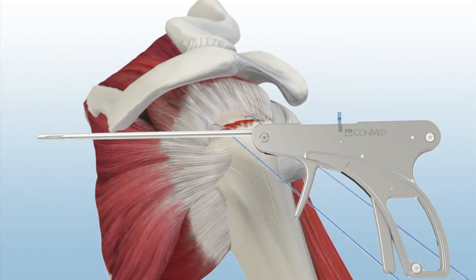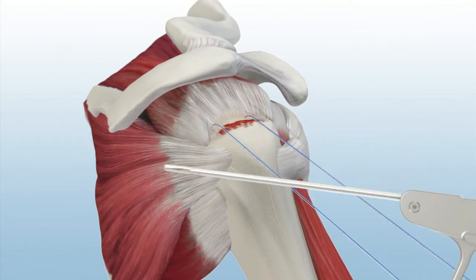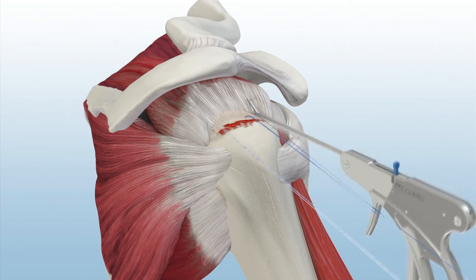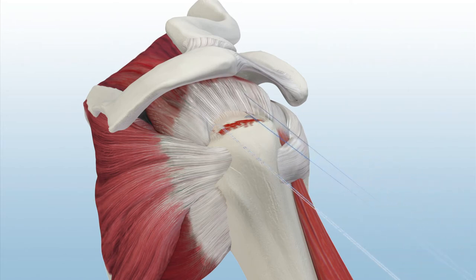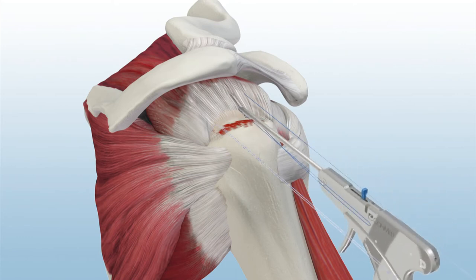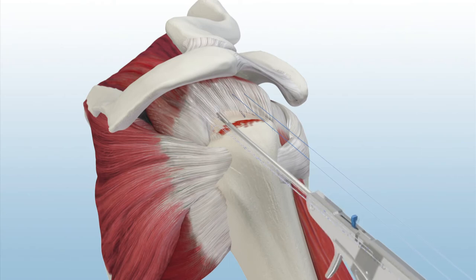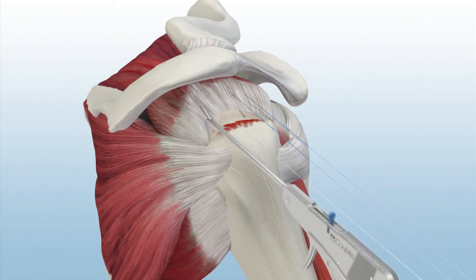The Spectrum AutoPass Suture Passer is used to pass a mattress stitch from each anchor. The other suture from each anchor is removed. The Spectrum AutoPass reliably passes suture in thick tissue and gives the surgeon the option of capturing the suture in the trap door or releasing the suture in the joint.